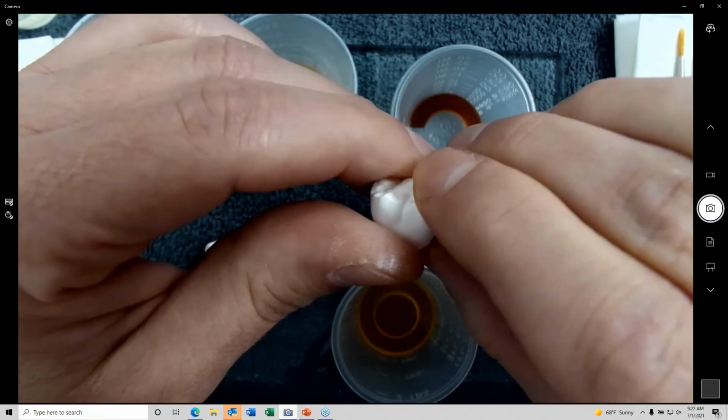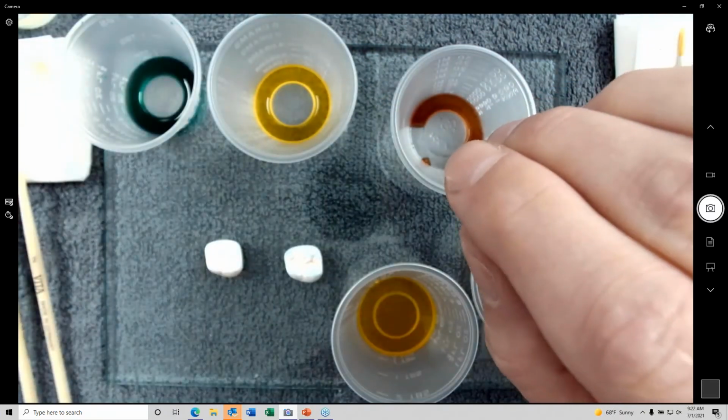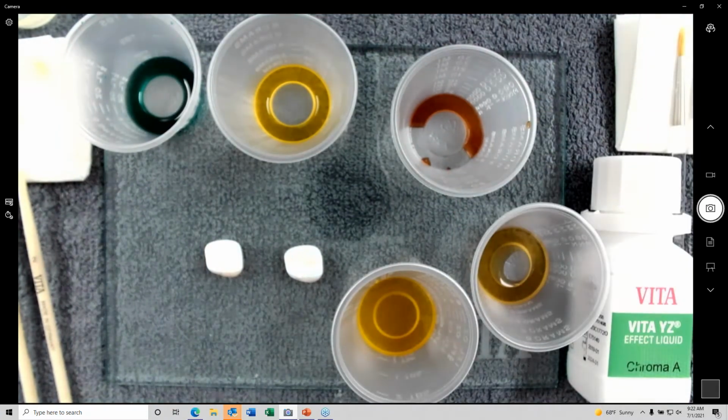when it comes out. So, if I have reduced the crown, the stain will be changed. If you've stained it and you grind on it, yes, the internal stains, depending on how much you add, do soak in.